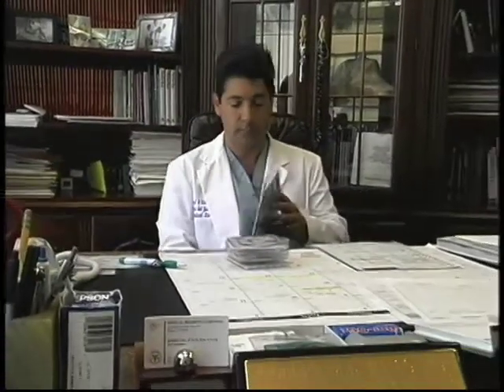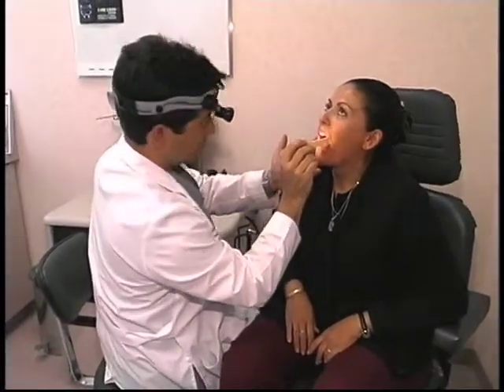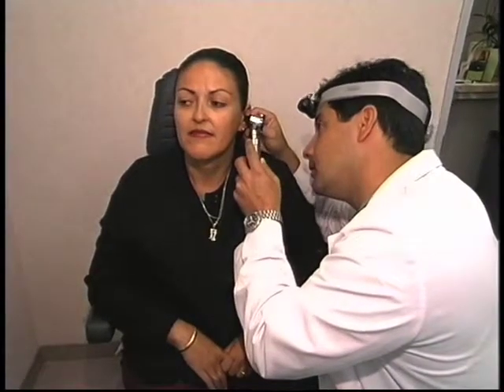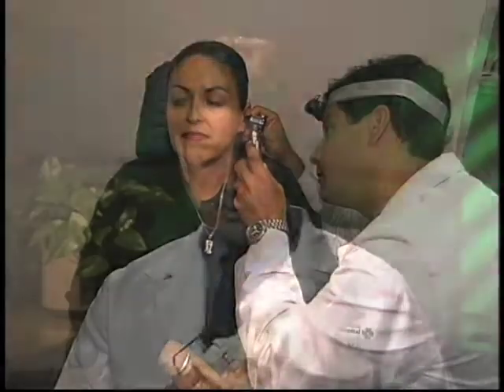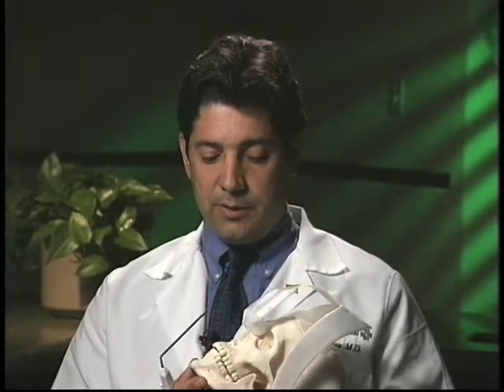We have a team approach of allergists, radiologists, and ear, nose, and throat doctors, and have tremendous support from the manufacturers of all this new technology. Most people who need image-guided nasal surgery are patients that have chronic sinusitis and nasal polyps, and on a rare occasion, intranasal tumors.